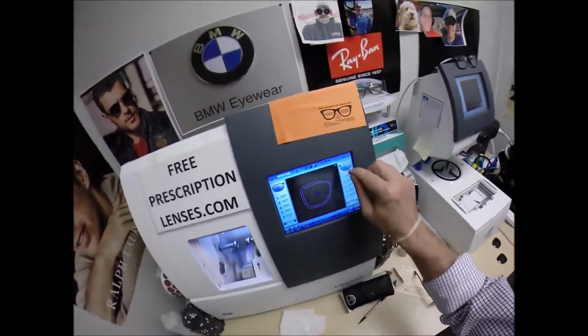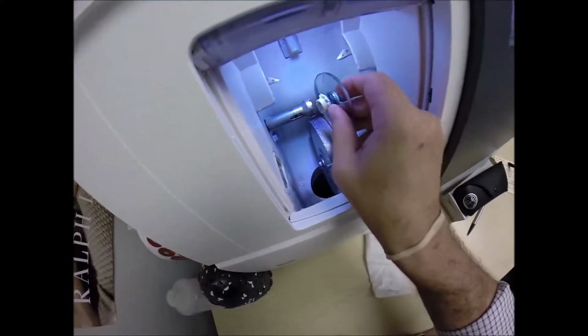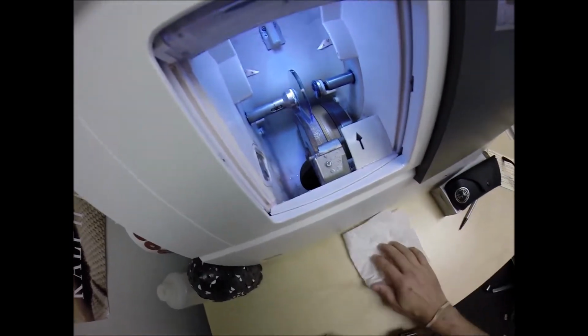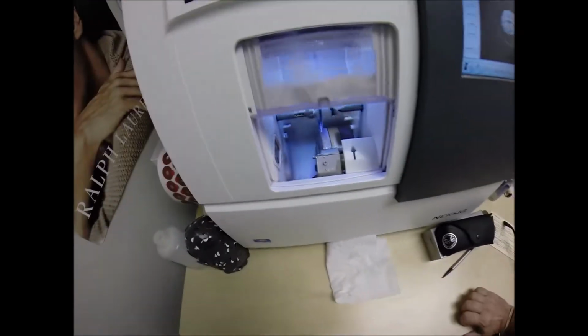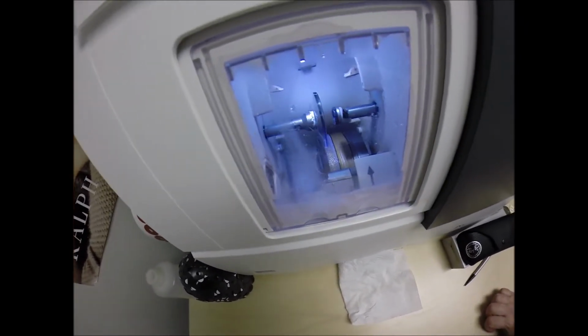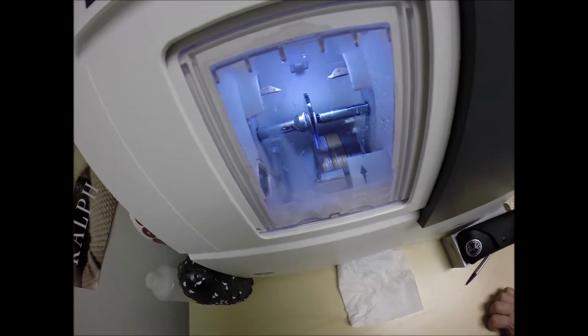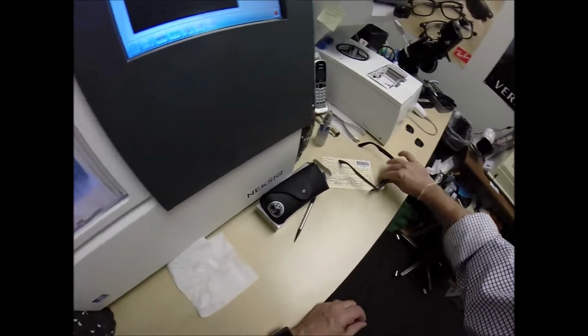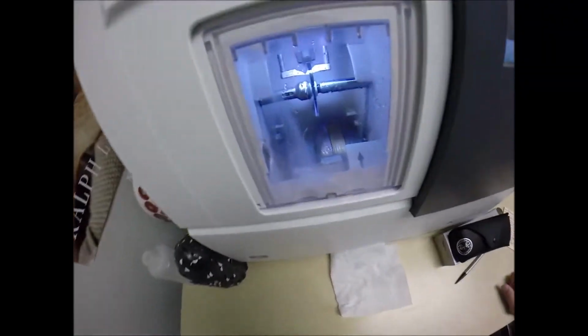Let me do the same thing now for the left lens. Press that on there firmly. Place the magnet into the Chuck, the Charles, the Chucky baby, or the Bumbino as I call it tonight. Hit the green arrow to start, just like before. The door closes, the clamp shuts. Now we will quickly cut the left lens on size this time. Hopefully we won't have to take it down anymore, and you can see as it's going around tracing the shape of the left side of the frame.